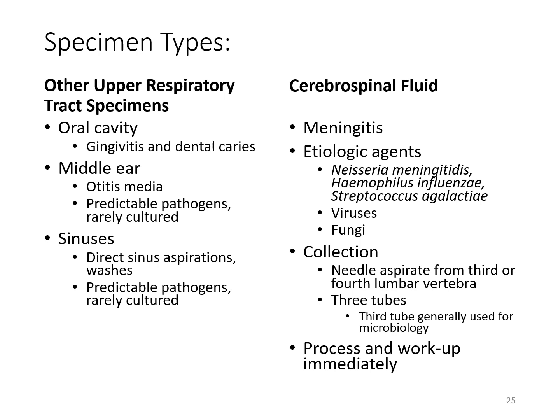These specimens are considered stat specimens, so if a CSF comes into the lab, you are going to process it immediately. So you're going to have to find a stopping place for what you're doing to address the specimen quickly. And that's just to maintain the viability of it, and plus too, if you're doing a spinal fluid, it's a pretty serious infection that can be life-threatening, so it would be an emergency to get those results out.